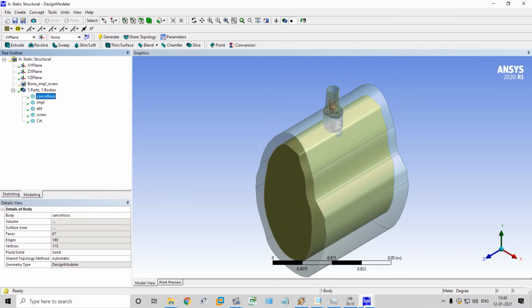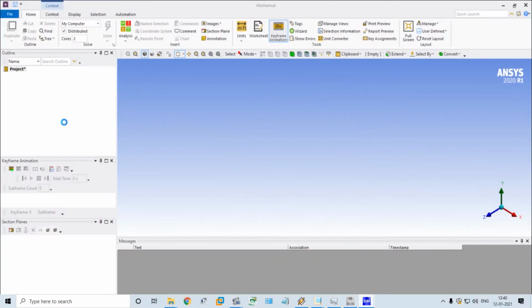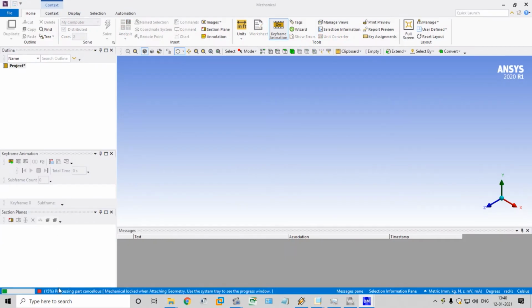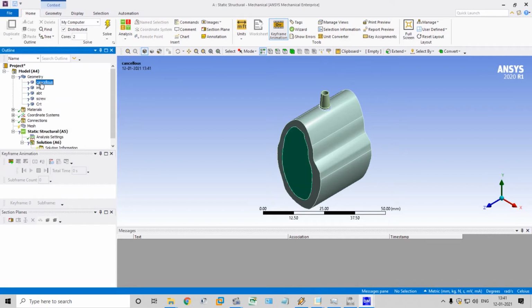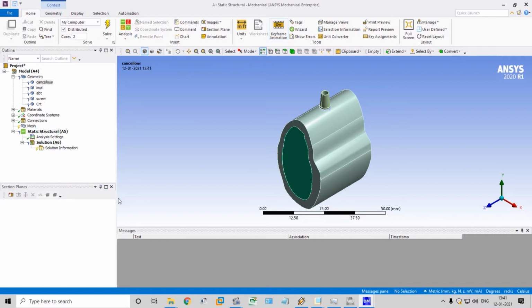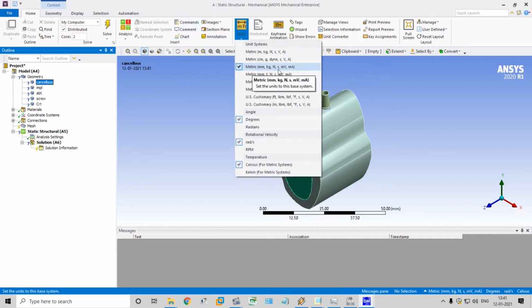Okay, geometry, sorry, here mechanical, it's getting loaded. Transferring part assembly, all the parts will be assembled here with names, what we have given in the design modeler. Geometry, 5 parts assembled here. Okay, model. First of all units: metric unit, millimeter, kilogram, newton, second, millivolt, milliampere. This is apt for a millimeter assembly.